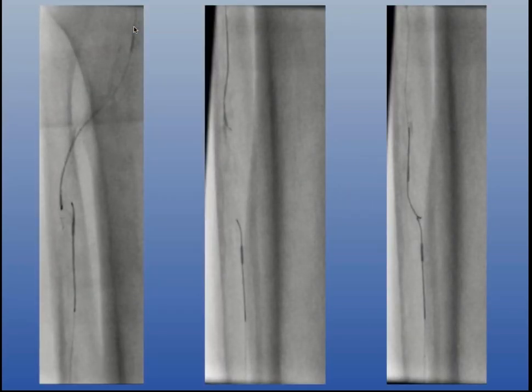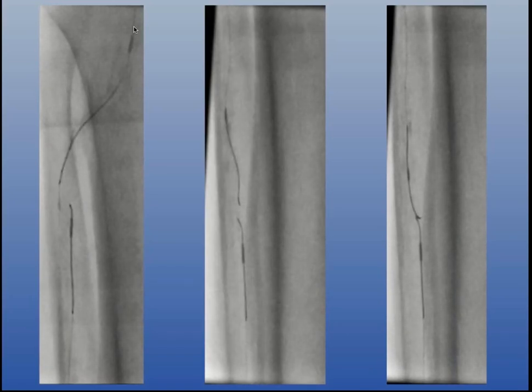And here's an example of what tip load looks like. On the left, I've got an image of a low tip load guidewire, 2 to 4 grams. In the middle, I've got maybe 10, 12 grams. On the far right is a 30-gram tip load. And I want you to look at how much bending or prolapse of the distal tip you get when you have a low tip load guidewire trying to do a recanalization. Look at the amount of prolapse you get. In the middle you have less, and on the far right, it almost doesn't bend at all. But then the problem is that it's more likely to dissect and perforate. So you have to just be careful with higher tip load guidewires.